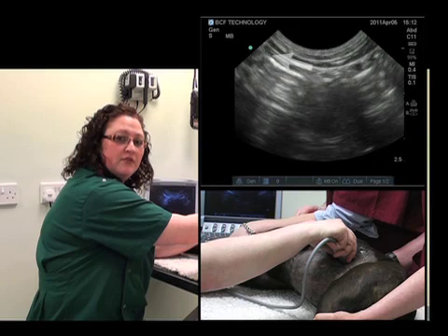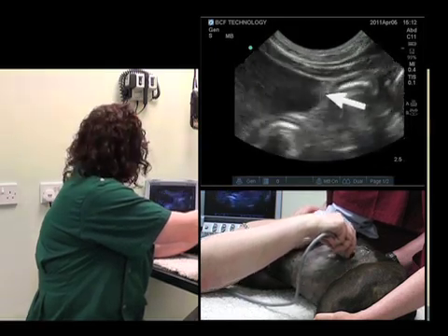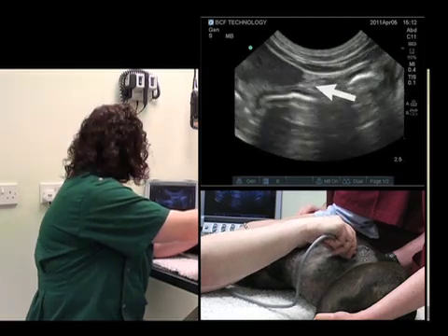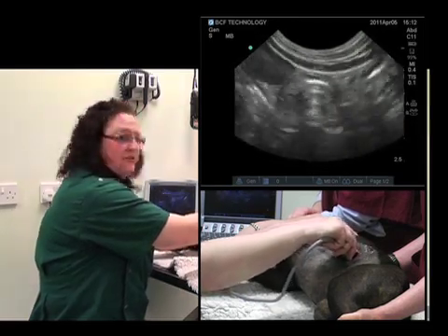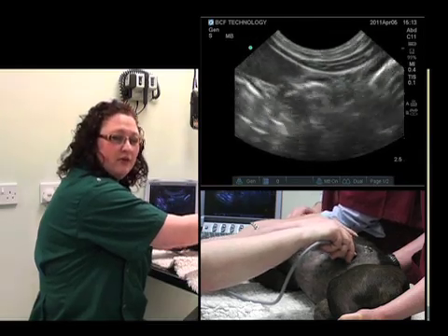The spleen goes out of view on the screen. If I release the pressure, the spleen comes back into view — it's on the left-hand side of the screen. If I apply pressure and then release pressure, the spleen comes back into view. So it's important to always bear that in mind.